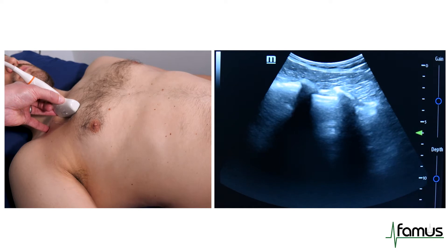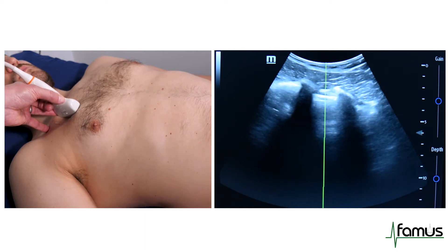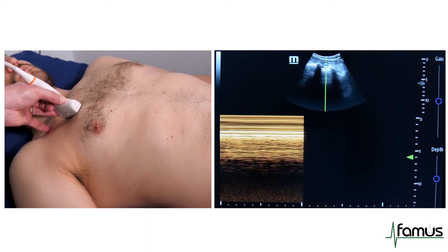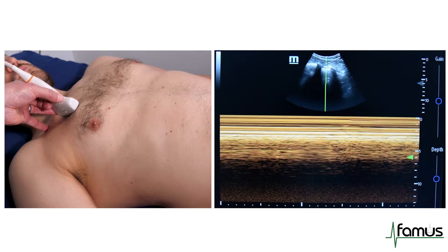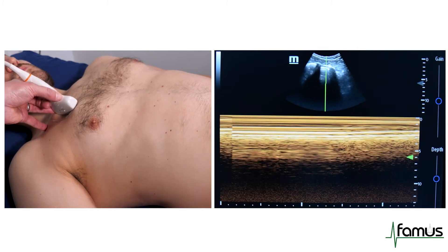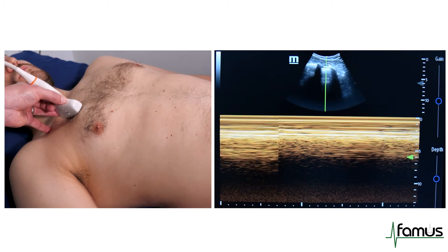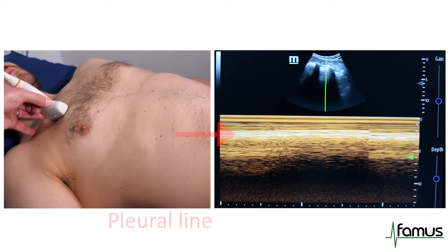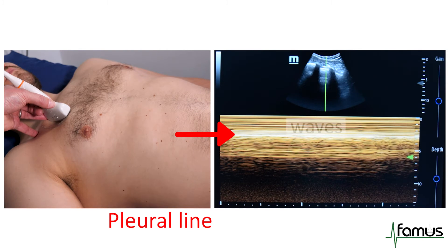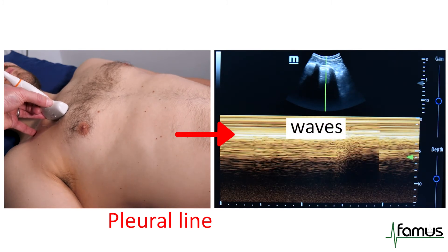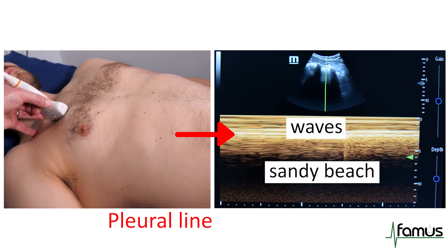The next thing we're going to do is put M-mode through the pleural line to demonstrate the seashore sign. As Sammy takes some good breaths in and out, you've got the pleural line which is the brightest reflection, with the waves landing on the beach above it and the sandy beach below — the seashore sign.